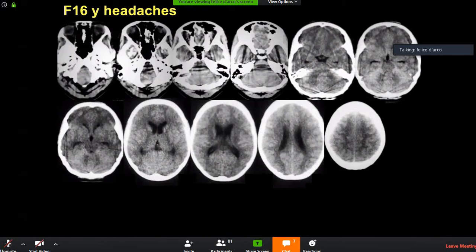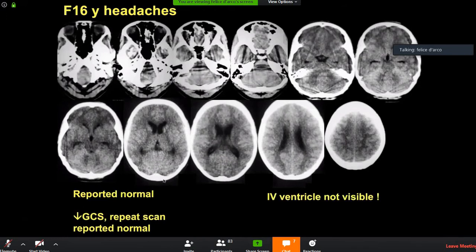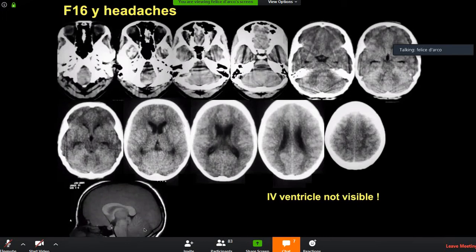In this case you couldn't see much on CT, but the area was a bit denser because of extensive leptomeningeal enhancement from medulloblastoma metastasis. The most important finding was that the fourth ventricle was not visible and there were signs of early hydrocephalus. This was a terrible scan reported negative outside — after two days the child died. The MR was done post-mortem. The fourth ventricle was gone and there was a mass with associated hydrocephalus.